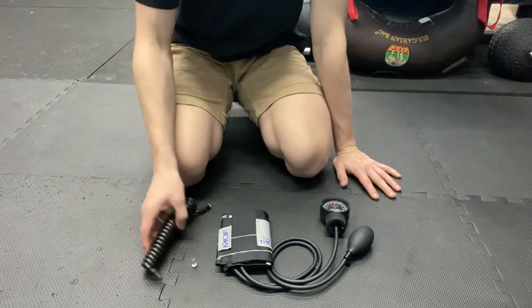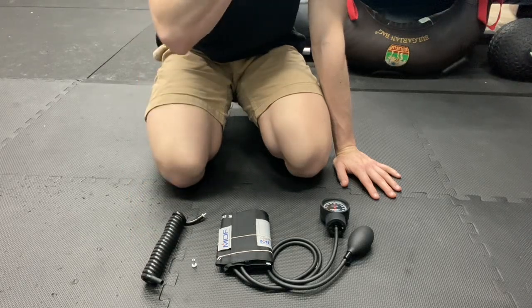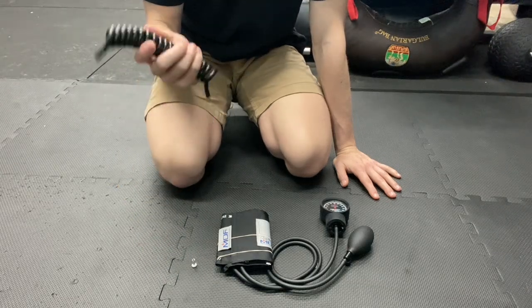And then you're also going to need an extension hose. This you can get on different medical websites. If you visit my website, odysseyholistic.com, and go to the resources tab, you'll be able to find a link for a website to buy one of these.